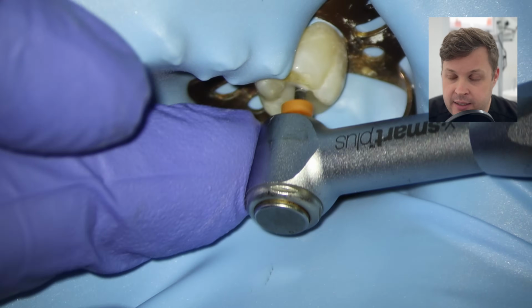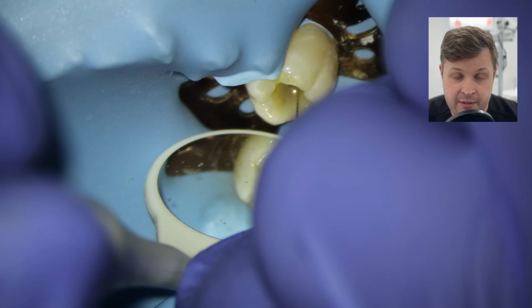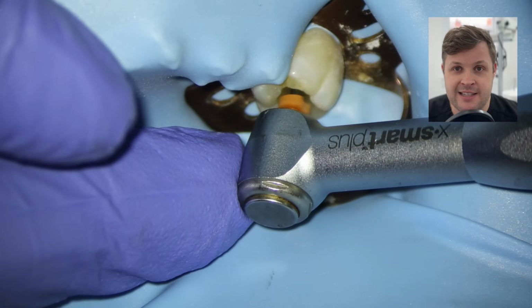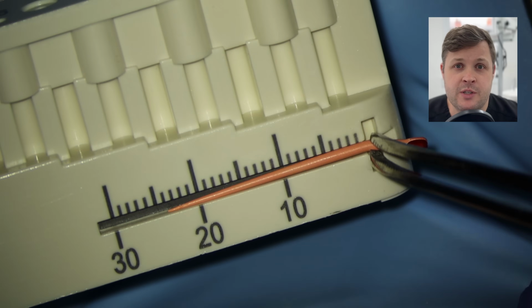So again, I've said this once, I'll say it 1,000 times in the video, don't push it. Just a couple of sweeps with your master apical file, that's the 25 variable, and then irrigation, and then lots of recapitulation with your size 10K file, and then the master apical file in the mesiobuccal canal reaches length. So at this point, what I want to do is check confluence.